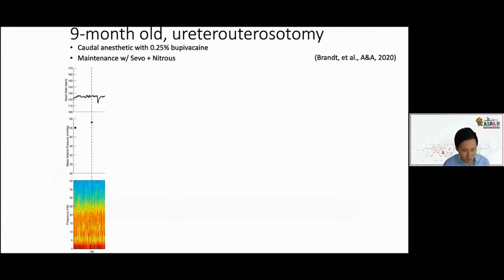During this case, we're at this point 195 minutes into the case. And during this time, I was actually present for this case. We were recording EEGs for research purposes. We could not intervene in the anesthetic. So the anesthesiologist was not aware of the EEG, wasn't using it, didn't plan on using it for monitoring, was just doing the normal monitoring of heart rate and blood pressure.